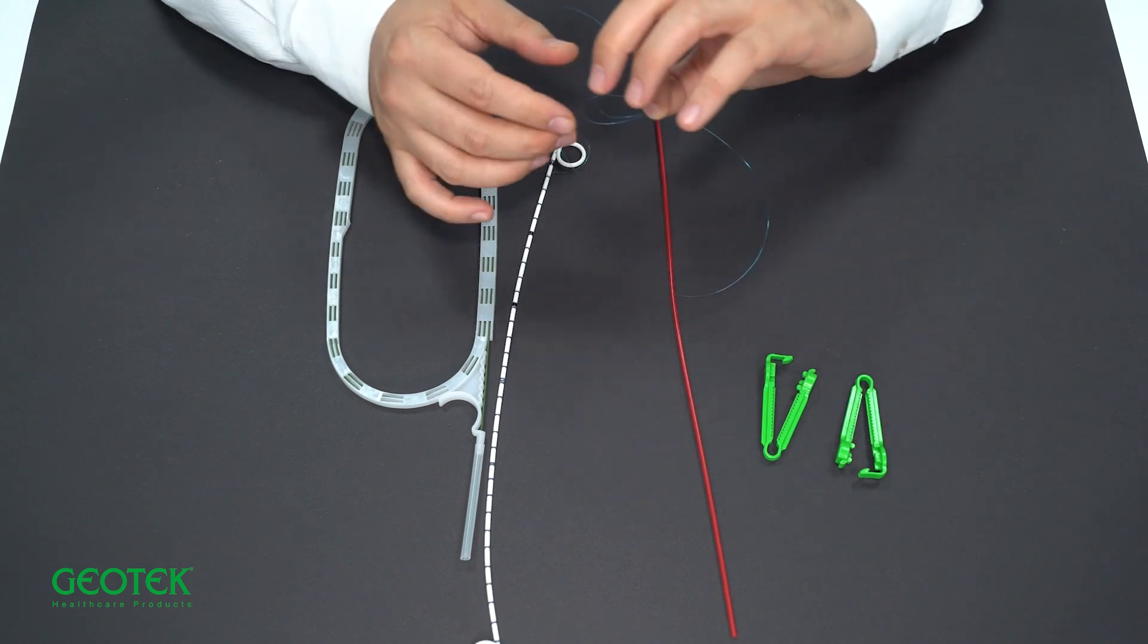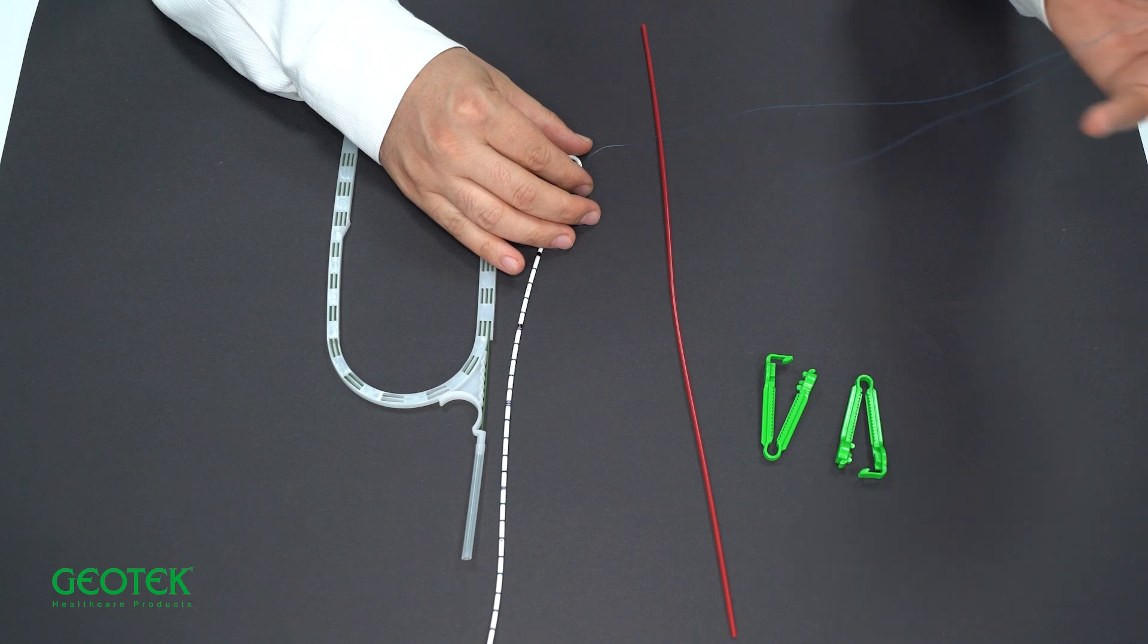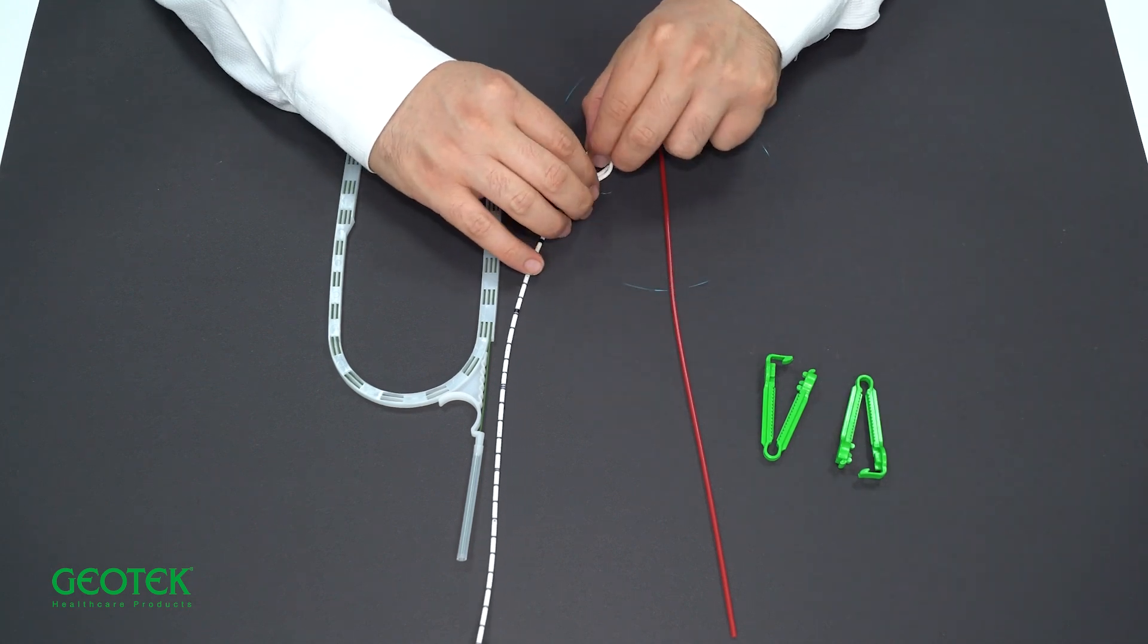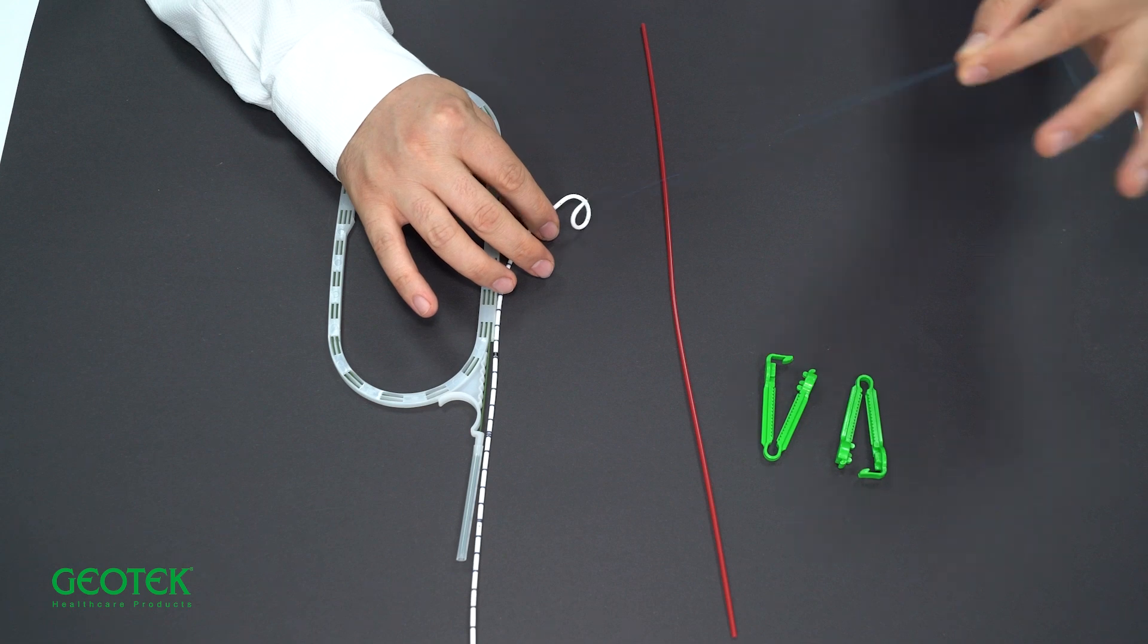In open surgery, the fixation sutures at this end are usually used to connect the stent to a urethral catheter. If open surgery is to be performed, this can be used for fixation.